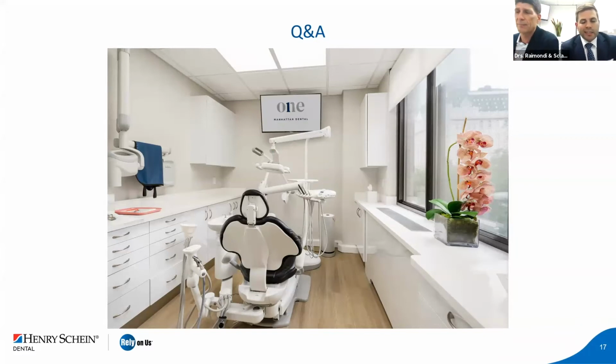And it doesn't look like it's as easy as it is to come in and out, but it really can. The rubber is really soft and flexible, and it pops out pretty quickly. So I even tell my patients, listen, here's the deal. If you need to take it out, just tell me. It takes 1 second. You can pull it out yourself, or I can take it out, whatever you want. And you notice that people feel a little more comfortable with this huge thing in their mouth.